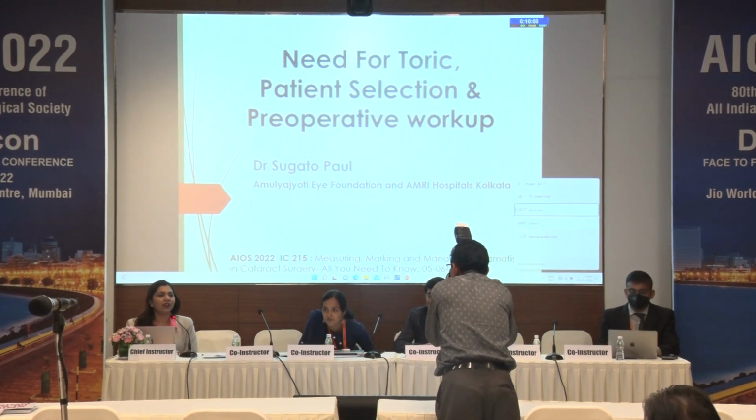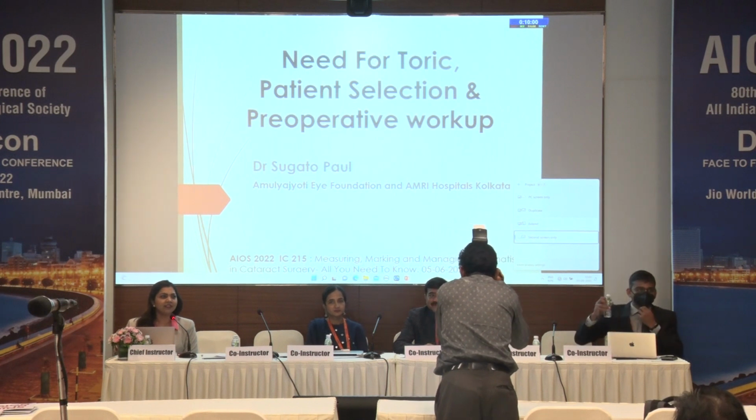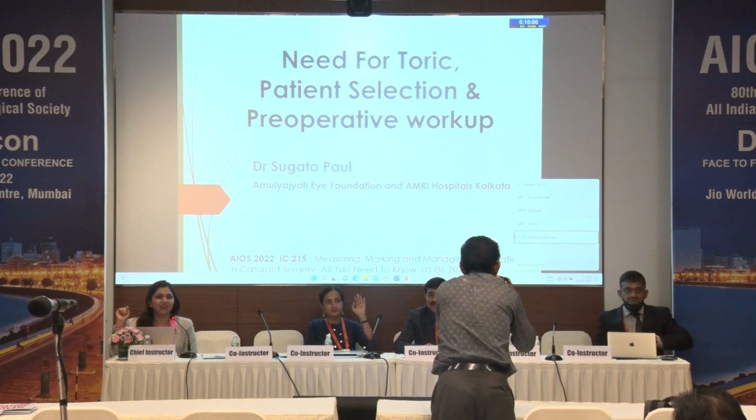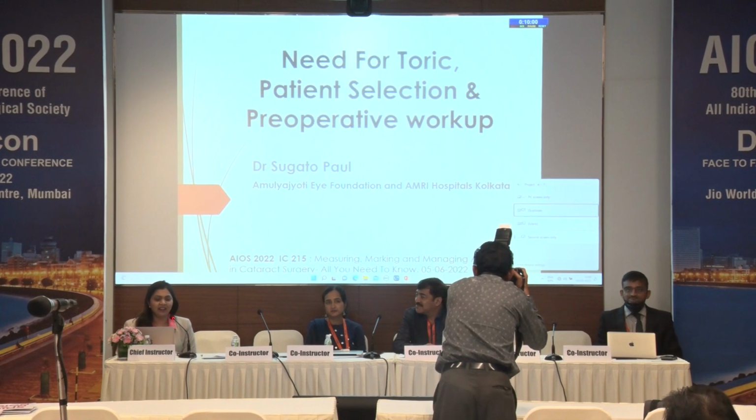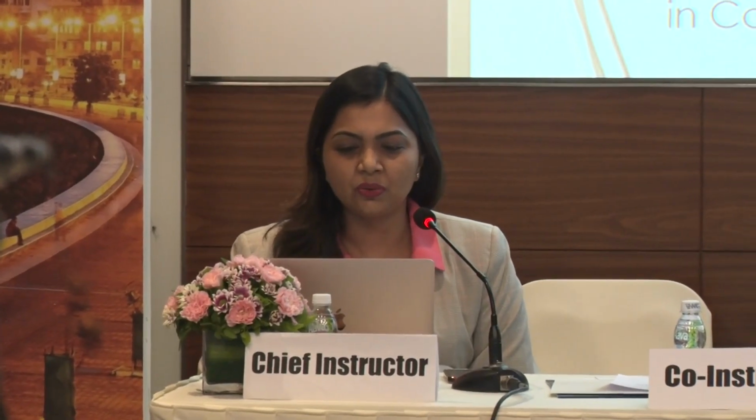So let me ask you, how many of us are doing Toric here? Can I have a show of hands? Okay, great. So I believe that once you're leaving the hall, everyone would be well versed with all the nitty-gritties and all you need to know about managing astigmatism. And it's like a once in a lifetime opportunity for the patient to see that clear, because giving the toric IOL close to the nodal point of the eye enhances the quality of vision beyond doubt.